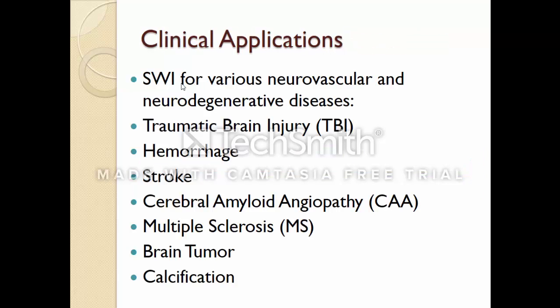So our new chapter is the clinical applications, and SWI is used for various neurovascular and neurodegenerative diseases such as traumatic brain injury, hemorrhage, stroke, cerebral amyloid angiopathy, multiple sclerosis, brain tumor, and calcification.